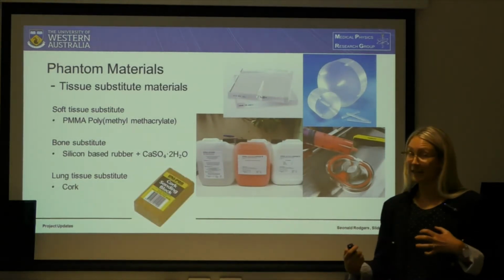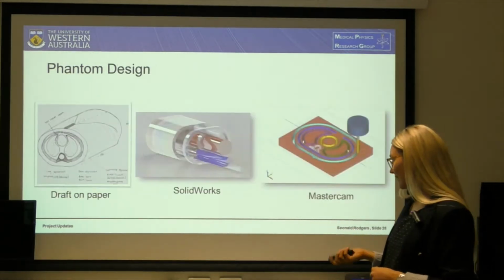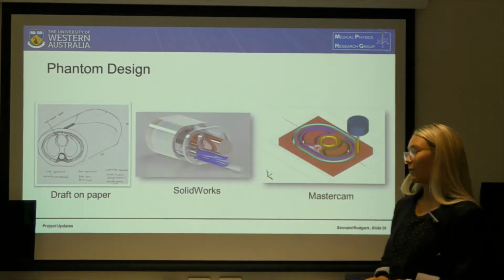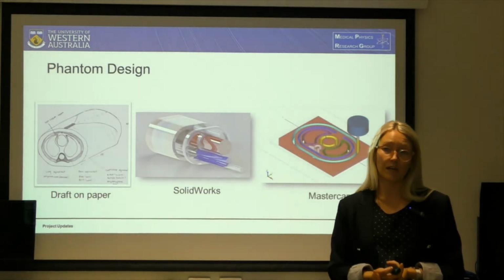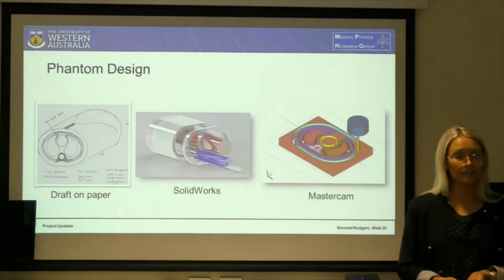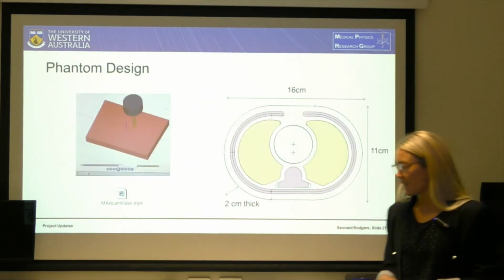So I used sanding blocks. They were really cheap, easy to get from Bunnings. So the design of the Phantom started off as pen and paper, and it really first came to life with the help of the engineers in medtech and physics using a computer-aided engineering software called SolidWorks, which was later transferred to the MasterCam program, which is compatible with the CNC milling machine in medtech and physics.